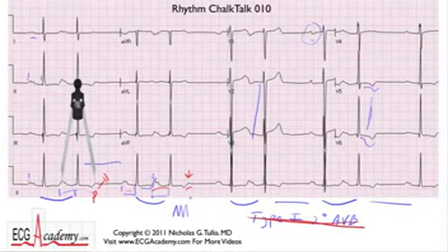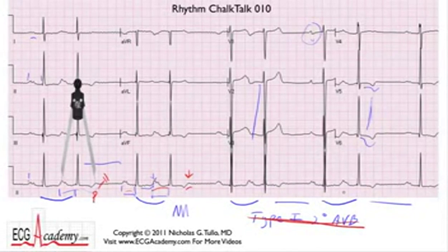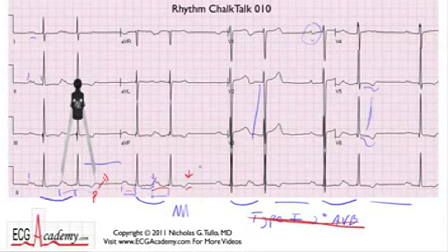This is a very common problem — we see it all the time. People make the mistake of calling it second degree AV block, but it's not. If it was second degree AV block, where's the P that didn't conduct? We should have a P wave that blocked, but it didn't. So how do we explain this? Since the P-to-P interval is clearly not marching through, what's the next likely diagnosis?